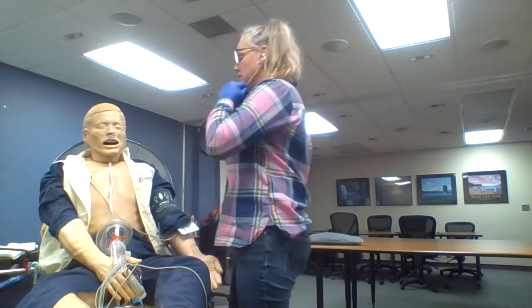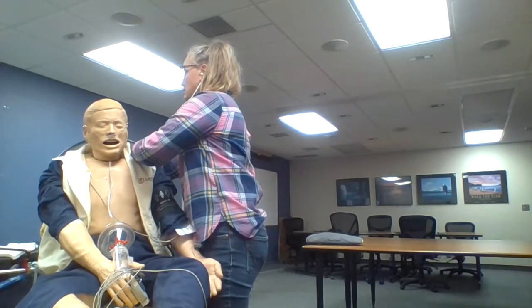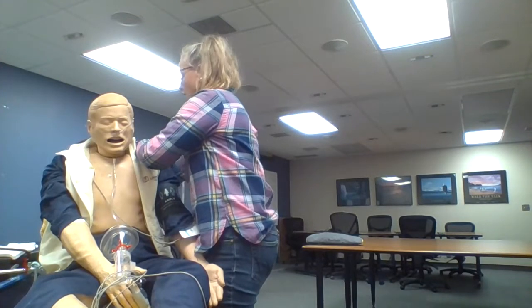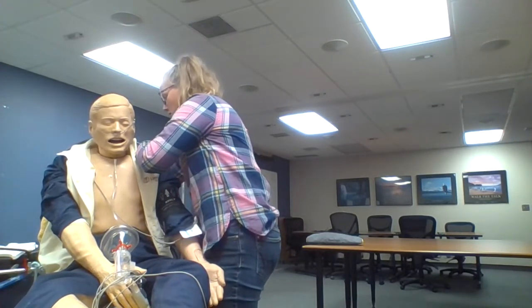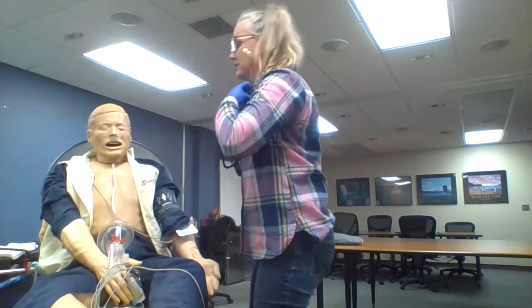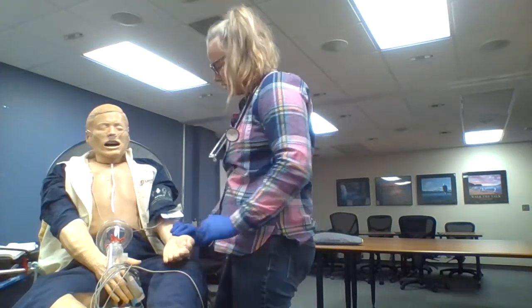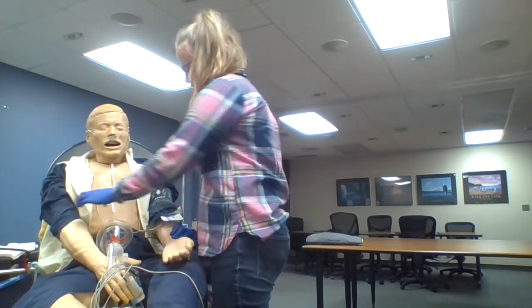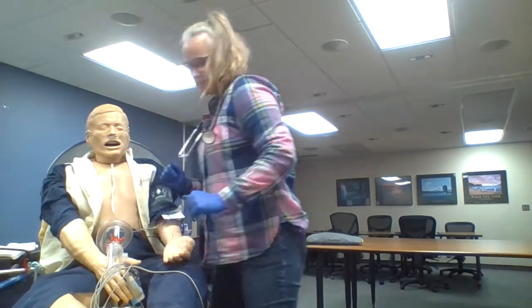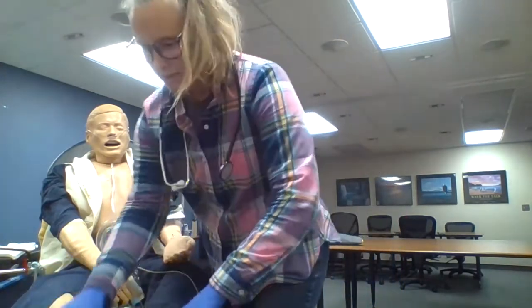Okay. So I'm just going to listen to your lungs. If you can lean ahead, I will listen to you at the back here. Okay, good. Down at the bases here. Good. I understand it's hard for you to take big breaths there. You're doing really well, okay? Just try to focus on that breathing. So your pulse still feels good and everything else, and I can see that you're using a little bit less accessory muscles, so that's fantastic. You're doing really great, and nothing has changed further down here for you.